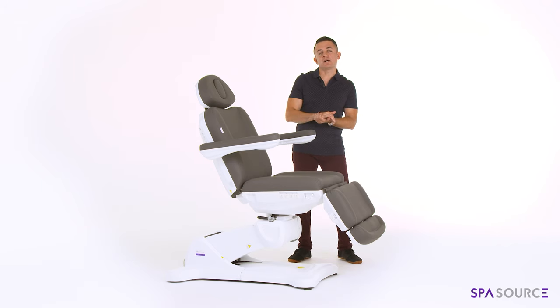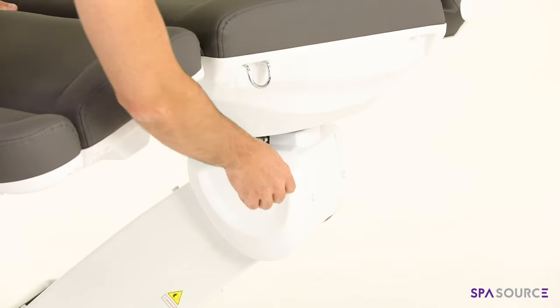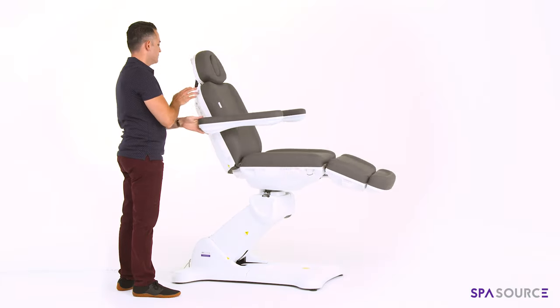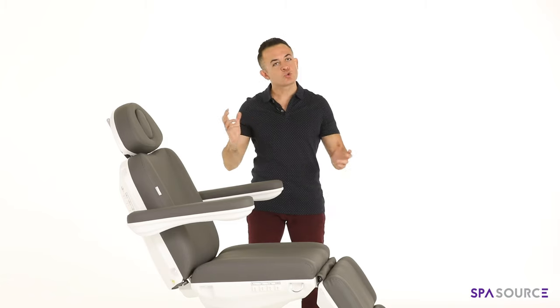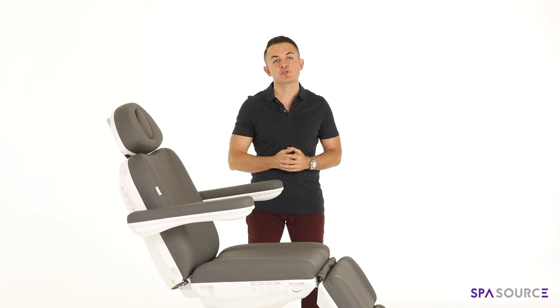One of the other main reasons why a lot of our clients prefer this chair is the rotation function. If you have any clients that are infirm, post-surgery, or just elderly, it's very easy to simply loosen the lever, twist the bed, lock it, and get them in and out of the chair much easier.